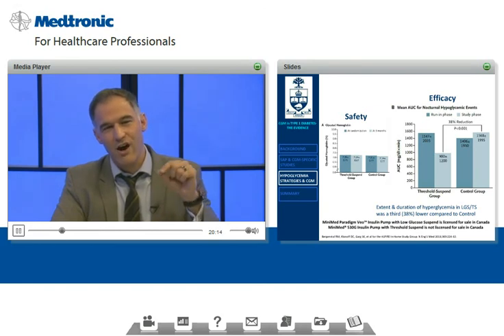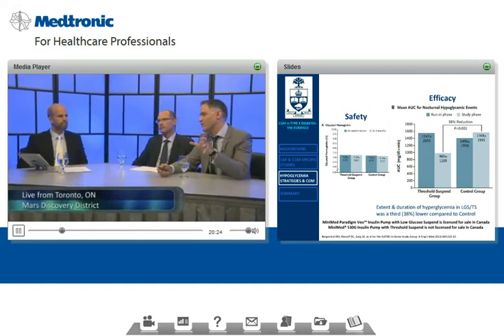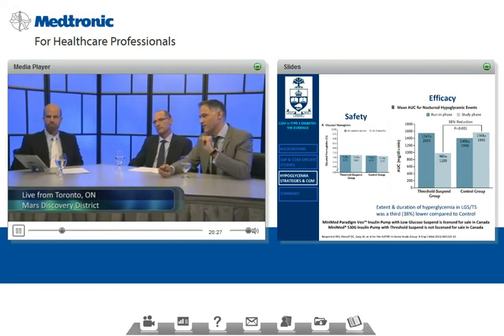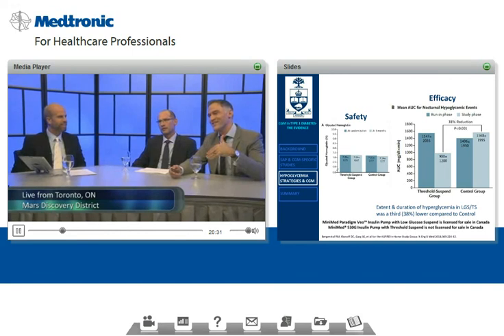So you could say that on average, people are getting half a millimolar of blood glucose less hypoglycemia over a full hour. That didn't make any sense. Did that make any sense to you, Josh? The idea is that there's less hypoglycemia.